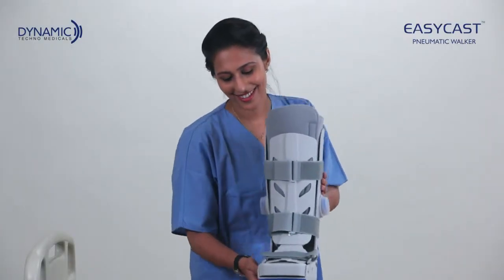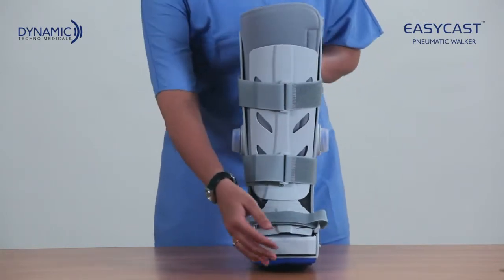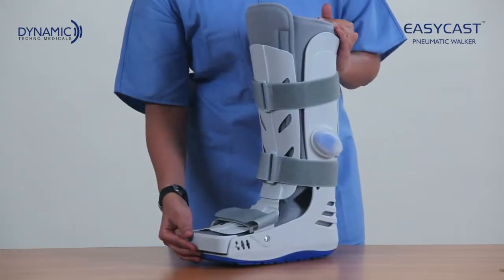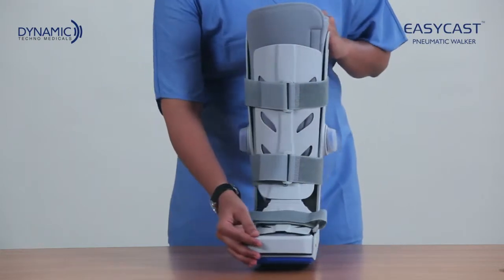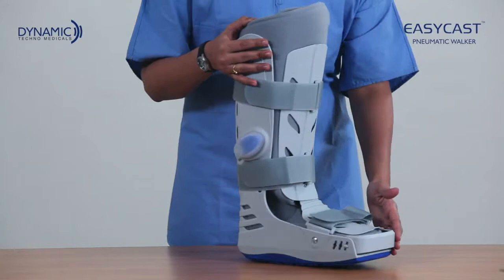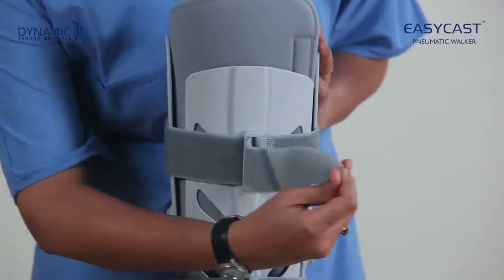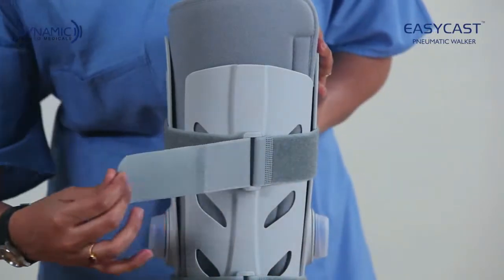Dynamic Techno Medical presents the EasyCast Pneumatic Walker. EasyCast Pneumatic Walker is recommended for ankle sprain and post-operative conditions. EasyCast provides freedom of movement with uncompromised healing, and has Velcro straps for easy application and removal.